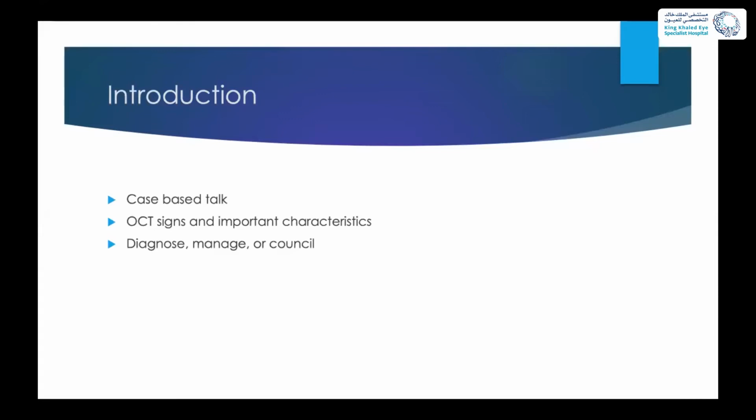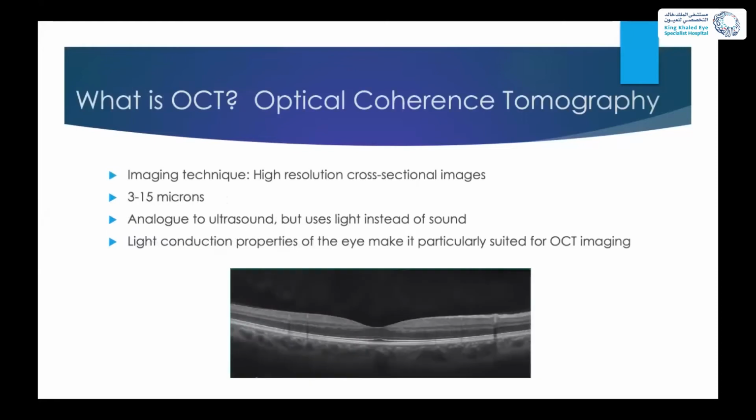Just a reminder, these signs are not pathognomonic for some diseases, but they are characteristic for some disease or pathology. And this grand round lecture, inshallah, will be a case-based talk, and inshallah, it will be very beneficial for all. So before we start with the cases, just 2 slides about the OCT.